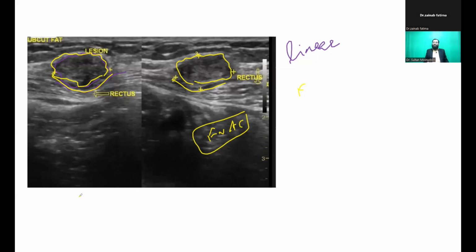Rashmi, scar endometriosis is when we see it in scar of the uterus. So suppose there is a uterus, and in uterus there is LSCS region, and in LSCS there is endometrial tissue which pains. That is called scar endometriosis. Here you are seeing it in anterior abdominal wall. Okay, this is rectus sheath. Okay, this is in anterior abdominal wall, subcutaneous fat. You can call it in case of the scar of LSCS which lie in the anterior abdominal wall.